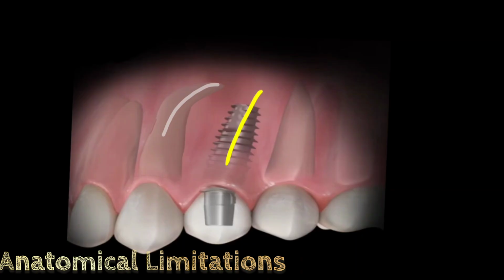But one has to understand that an angled abutment corrects the emergence profile of the implant prosthesis and not the biomechanical torque at the bone implant interface. The moment arm remains altered, so we must document it and reduce the occlusal forces accordingly.